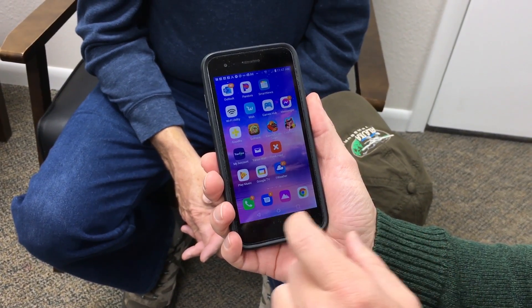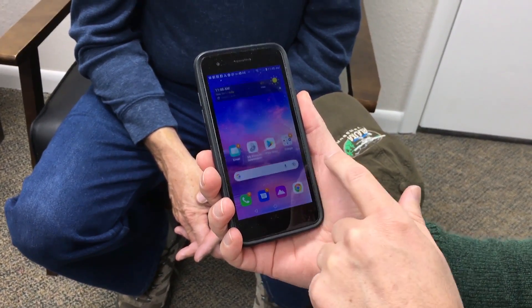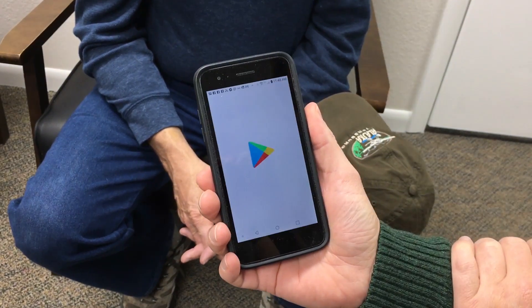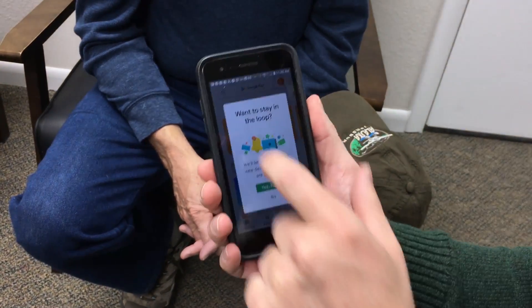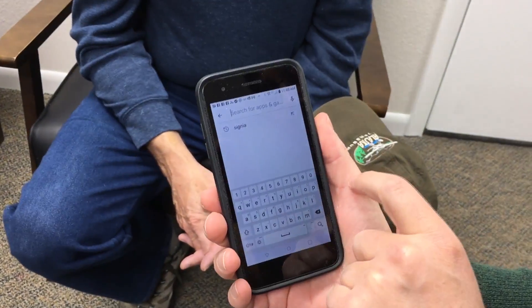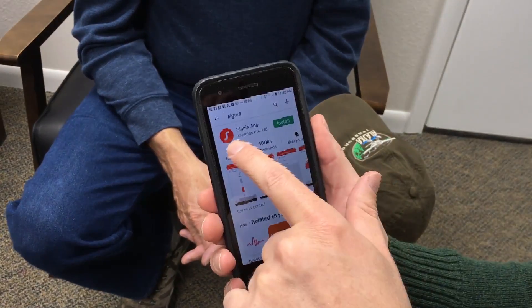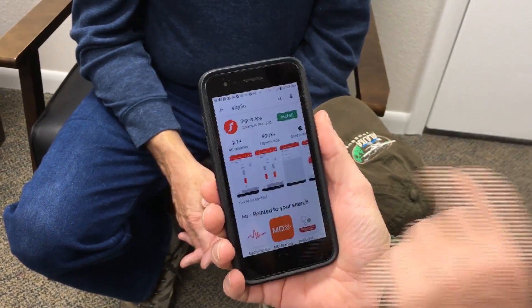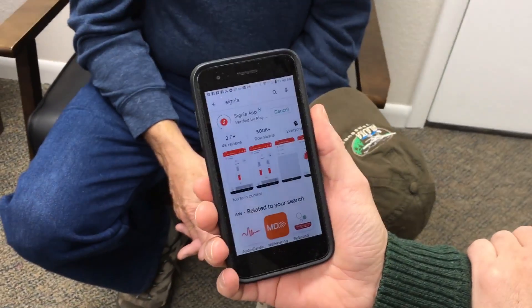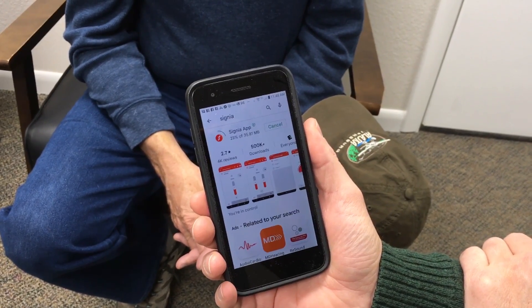Next we'll go to the Play Store. We're going to search for Signia — S-I-G-N-I-A. This should bring up the Signia app with the red S. We'll go ahead and install that and give it a minute to actually download.